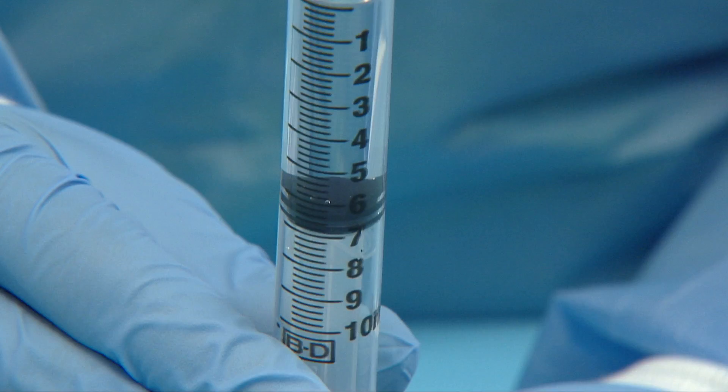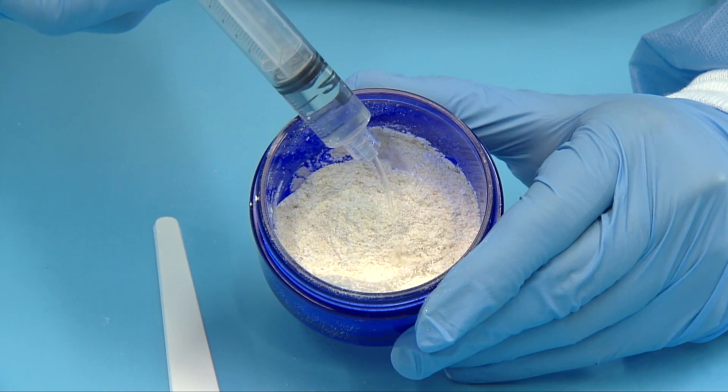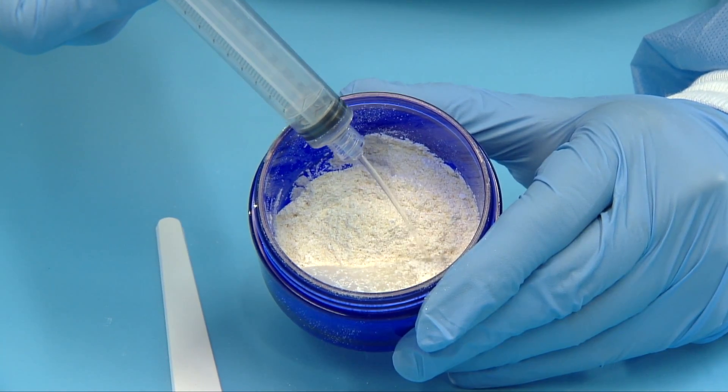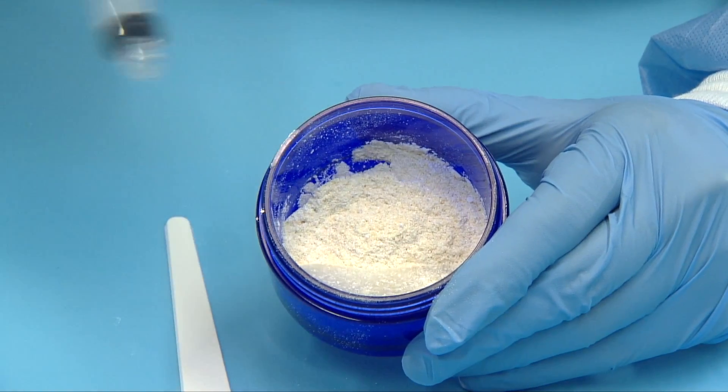Please note that using the incorrect amount of saline will adversely affect the handling and setting characteristics of the material. Dispense the saline into the mixing jar by firmly pushing it out to ensure all the saline is out of the syringe.